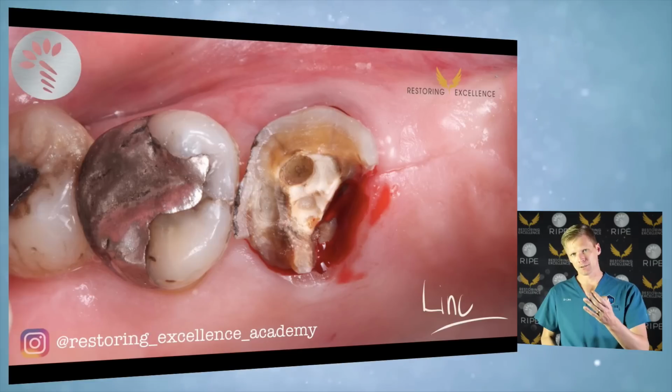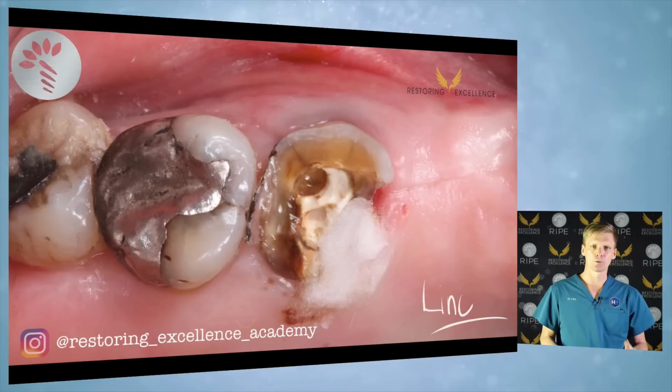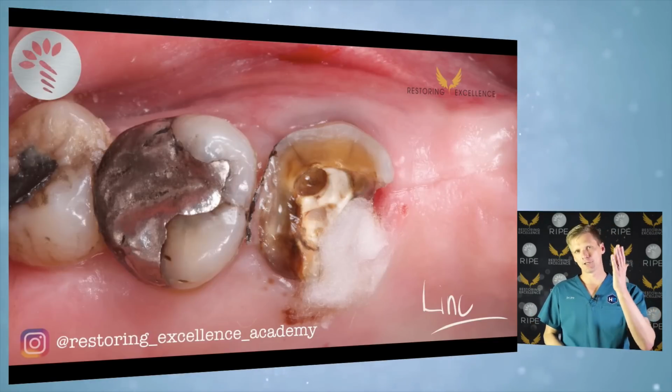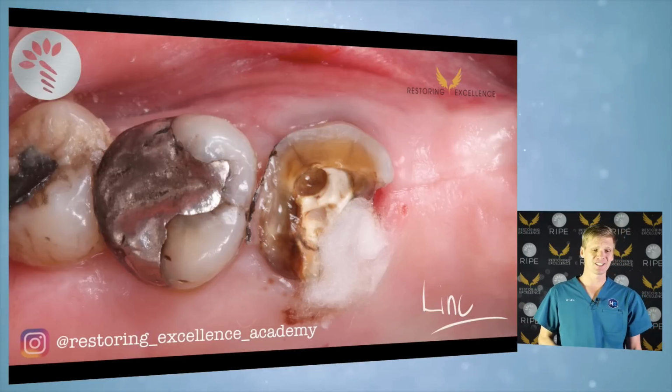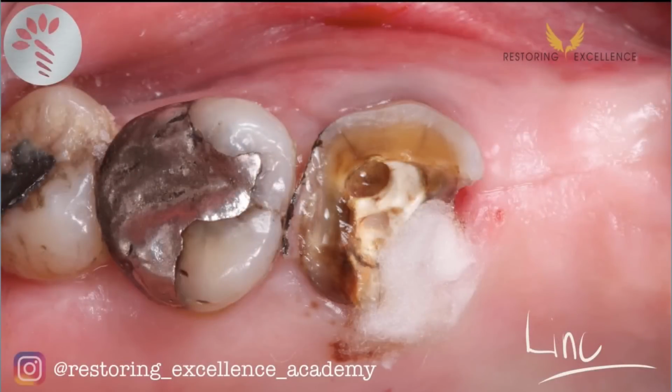So first of all, we've got to control the tissue. So there we go, we've got some cord in there, thick cord soaked in Viscostat, really packed hard, and then there is some cotton wool sitting on top. It's also soaked in Viscostat, it's packed hard as well, and then we wait. Okay, so we wait some time.